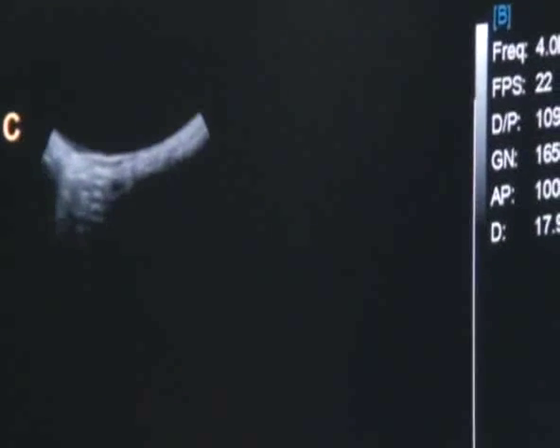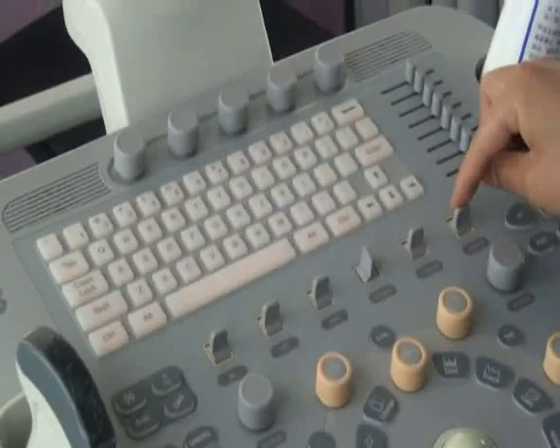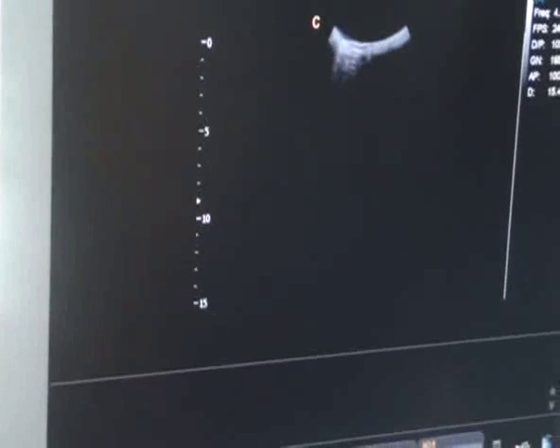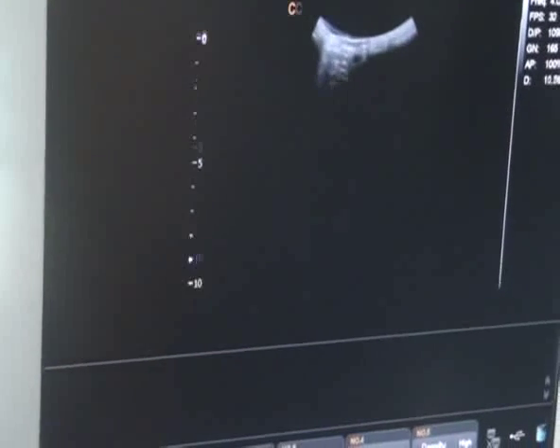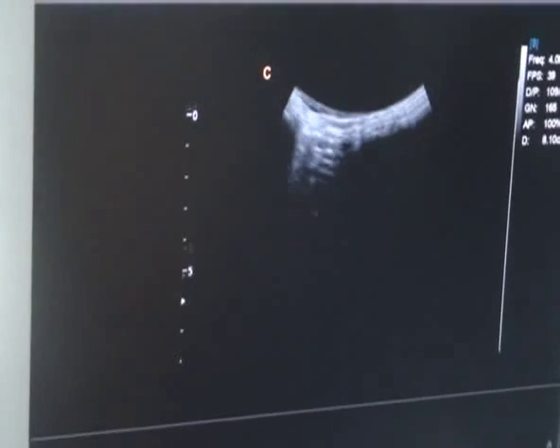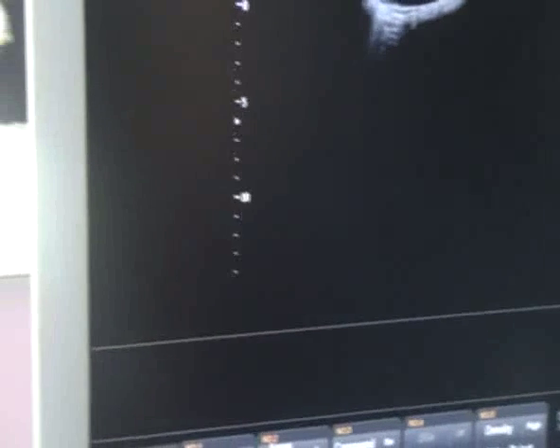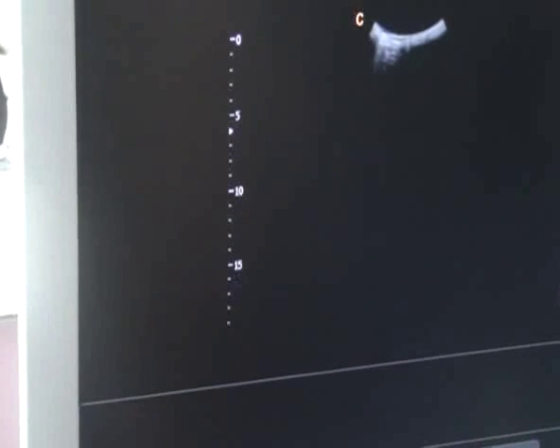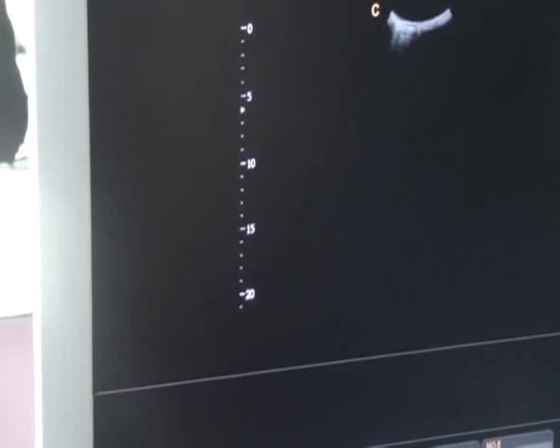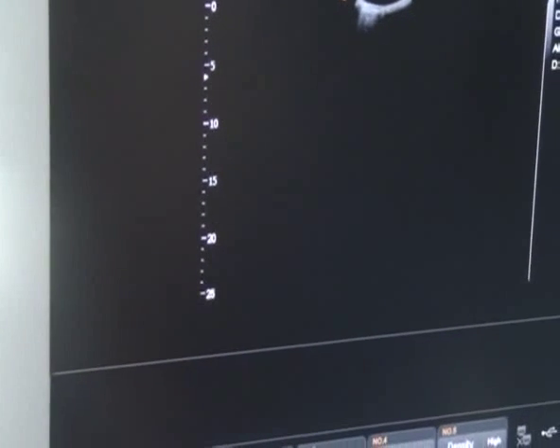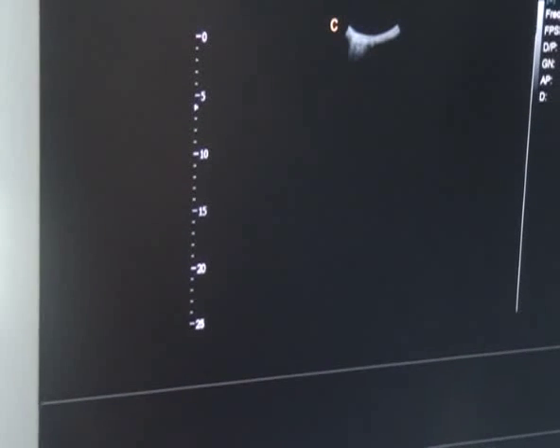For example, pressing up and down, we can change the depth — up to decrease the depth, down to increase the depth. We can change the depth according to the patient size.